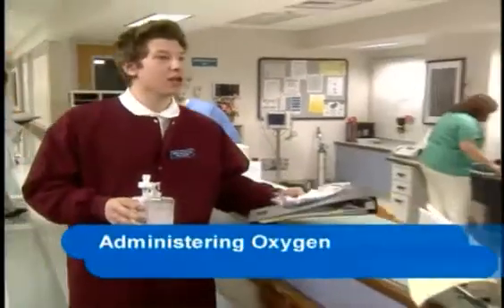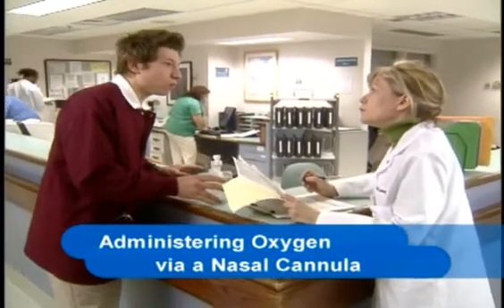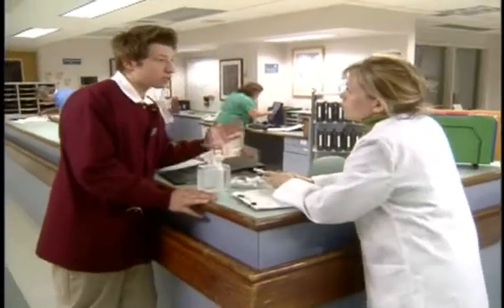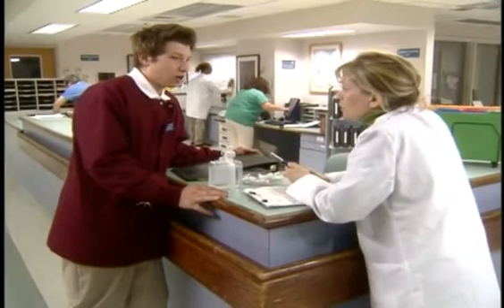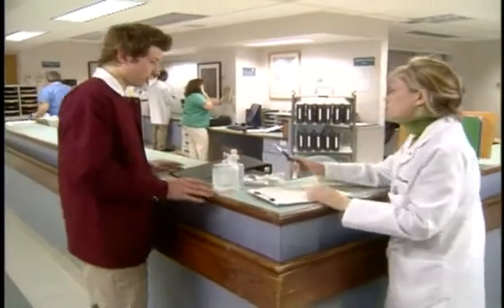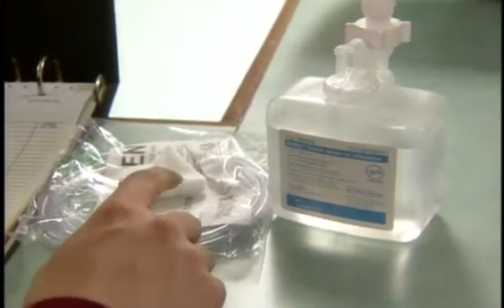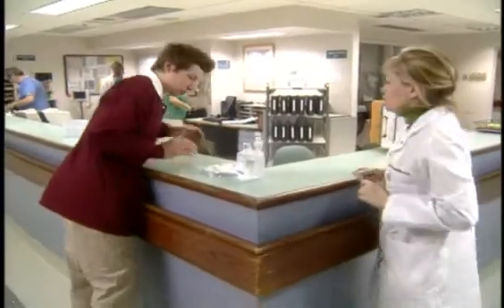Miss Lewis, I checked my patient's oxygen saturation level, and she had a reading of 91%. She was short of breath, and her nurse consulted the patient's physician, and she ordered oxygen. At what rate? 4 liters per minute. Will you come and help me set it up? Sure. Just check the physician's order and make sure that you've got all your supplies. Okay, we're good. Thanks. Let's go. Yep.